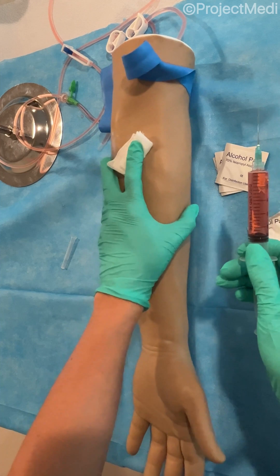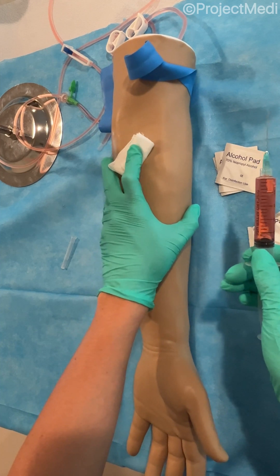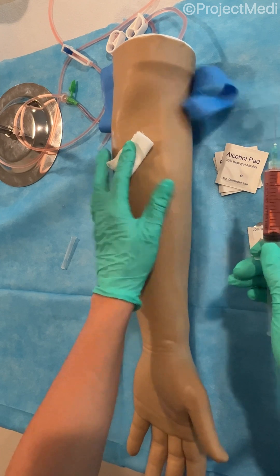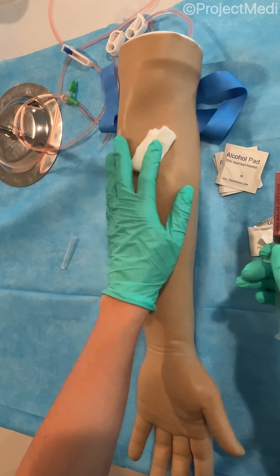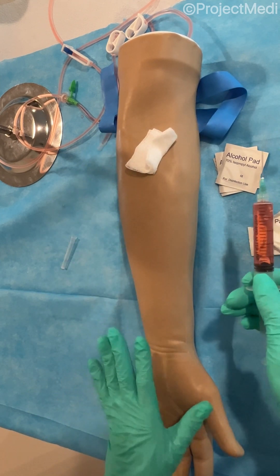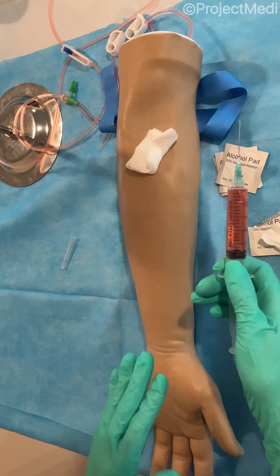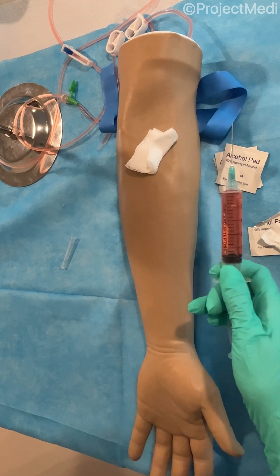You can apply some tape to the gauze. The bleeding should stop within about 20 to 30 seconds, and the patient can also hold that there. Ensure that they're comfortable prior to leaving and handle your specimens appropriately and according to your organization's policies. And that's it for the Project Medi venipuncture demonstration.